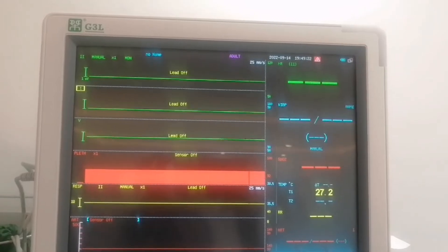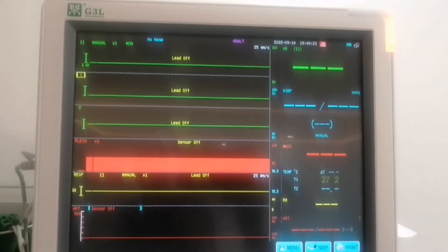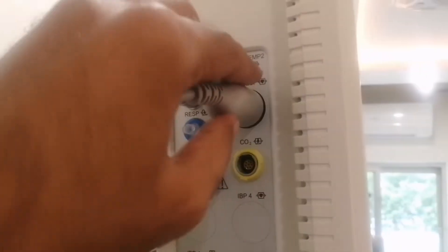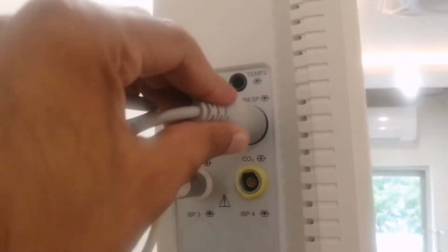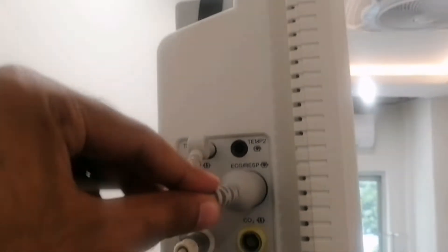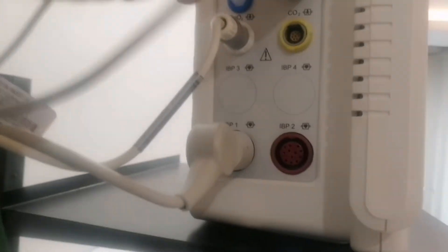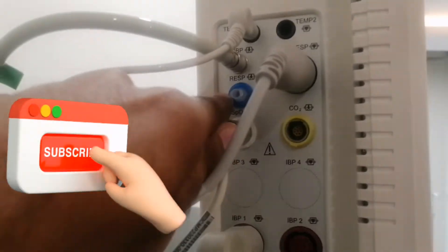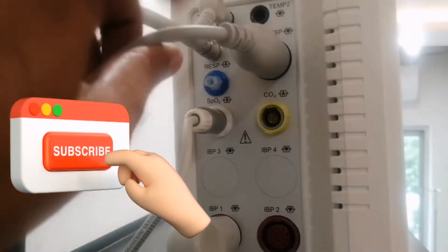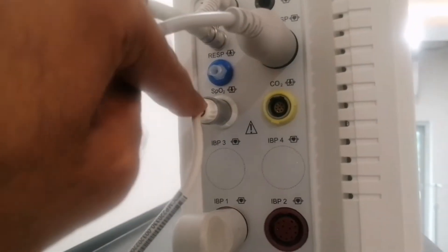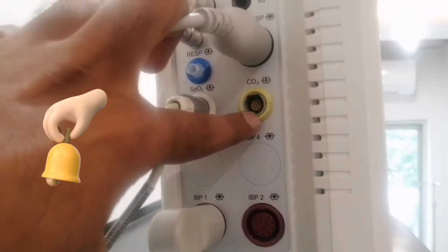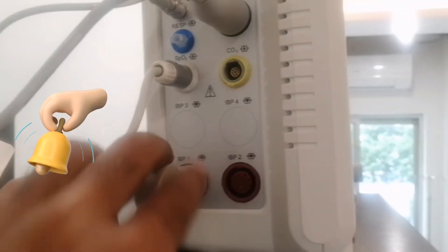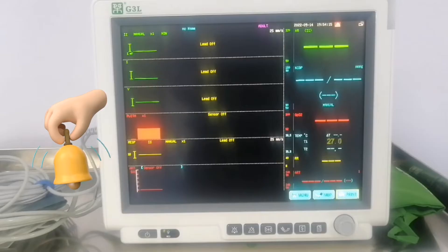Okay, this is an 8 parameter monitor. There is a temperature connector. ECG, respiration and NIBP. Here is the respiration. Here is SPO2, CO2 and 2 IBP.